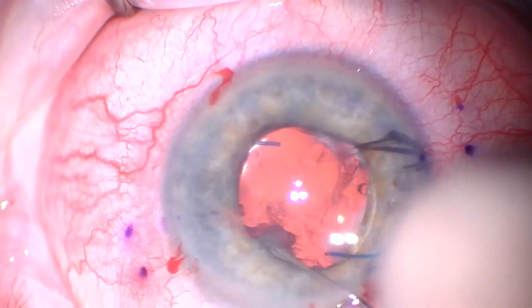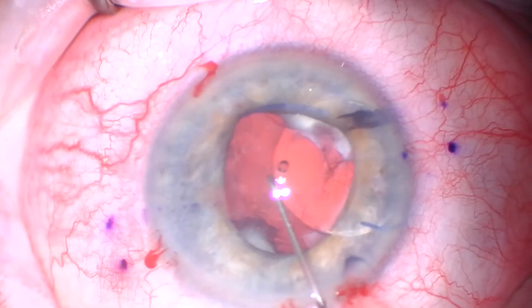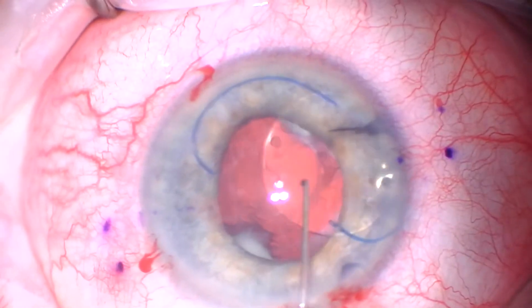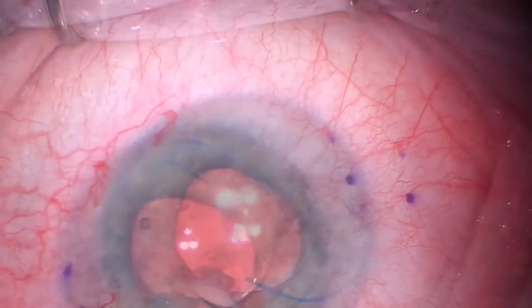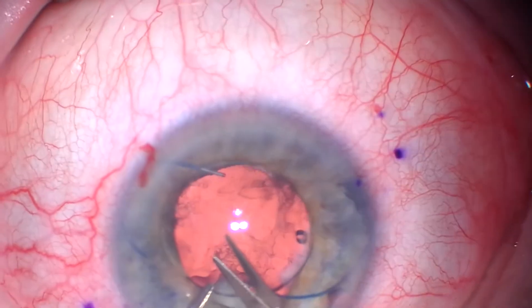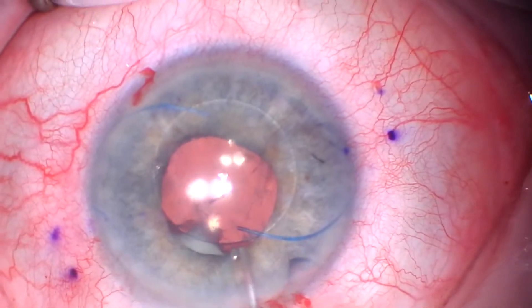She said that in the late 1970s she had a state-of-the-art procedure where they took her cataract out and placed this lens. Here I'm trying to cut it — and you'll see, it's not cutting. I was thinking it would be acrylic, but I guess it's PMMA or something.